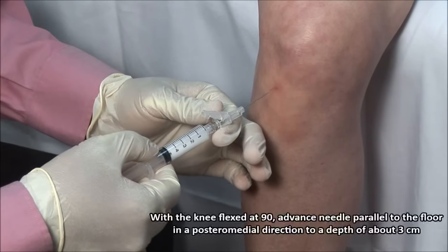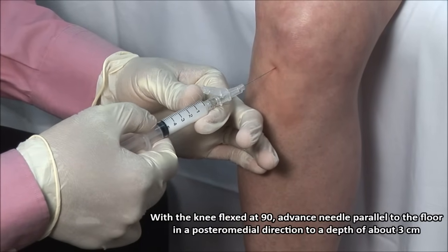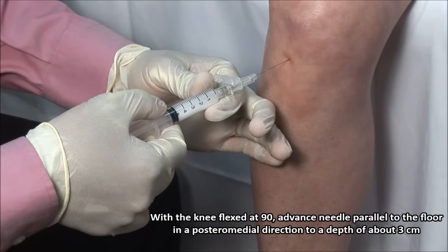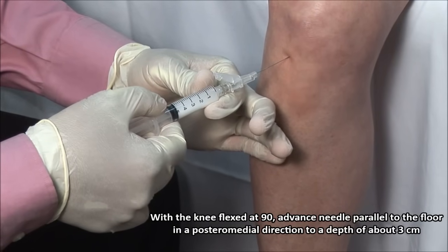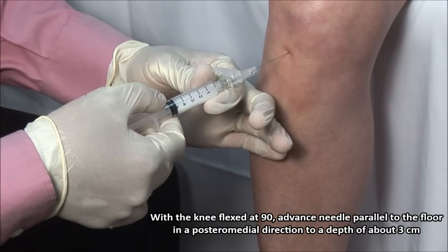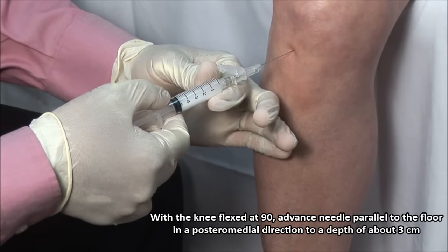Advance the needle gently through your mark. The needle should be held parallel to the tibial plateau and directed medially to an imaginary point in the middle of the knee, between the inferior aspects of the femoral condyles, to a depth of about 3 cm. You will feel a give as the needle breaches the joint capsule.